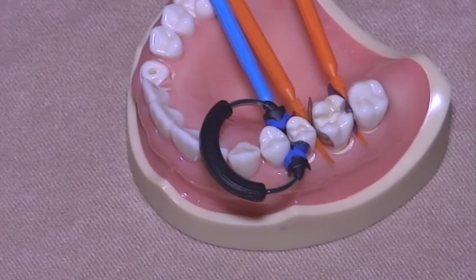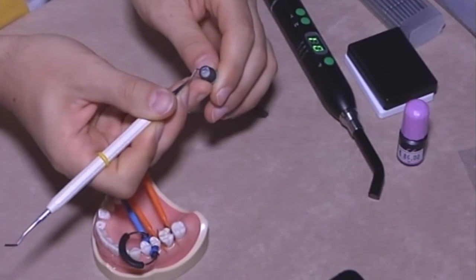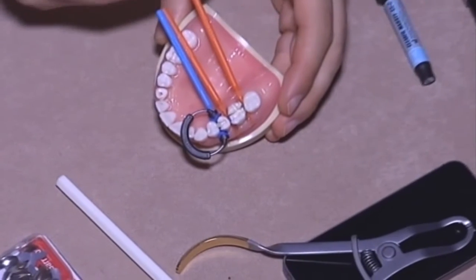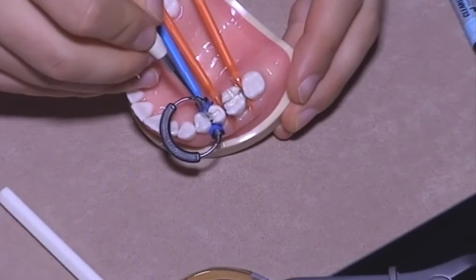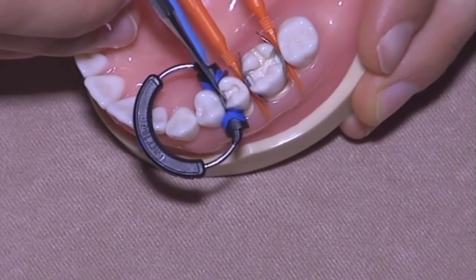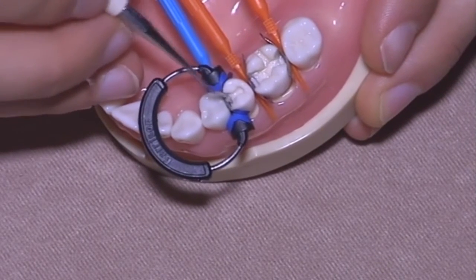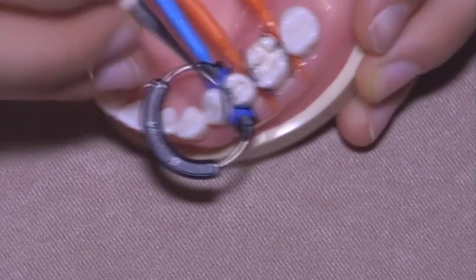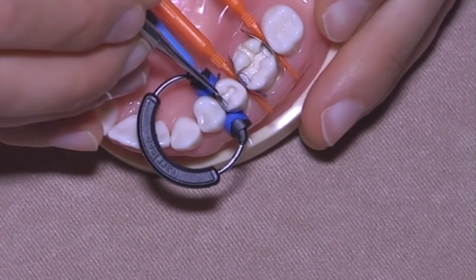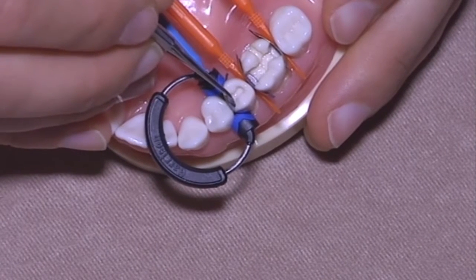And then with a single layer of composite, you can place it and you can start pushing the composite towards the matrix very slowly in order to create the interproximal wall. First, you have to take care to close the bottom of the cavity.